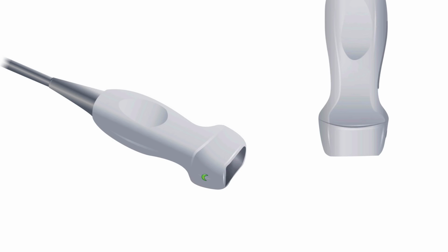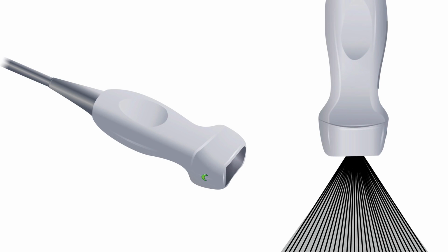The phased array, which is commonly used in cardiac imaging but can also be used for abdominal imaging, has a very narrow window, but has a very great splay. So this is very useful for cardiac imaging because the point of contact can be very small to fit in between ribs and around lung artifact, but has a very wide field of view.